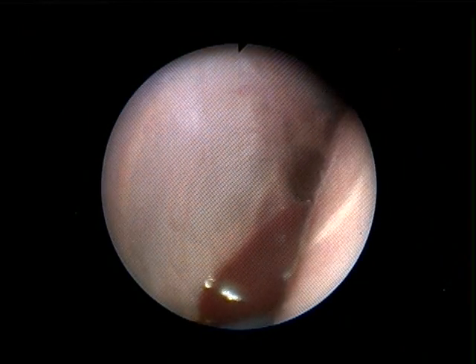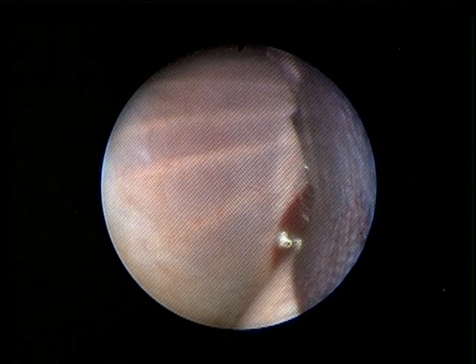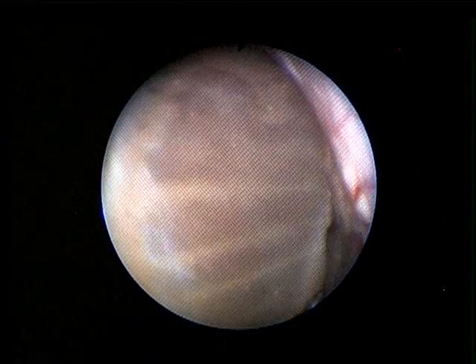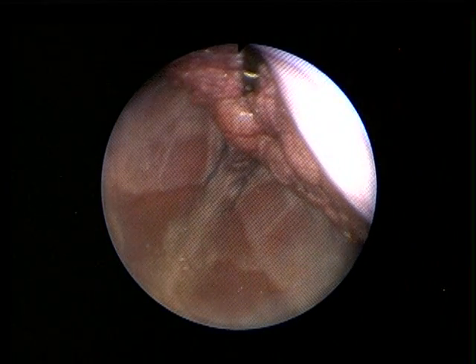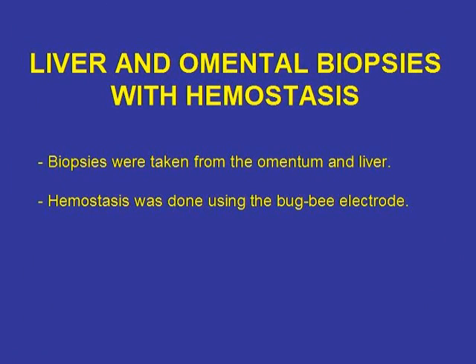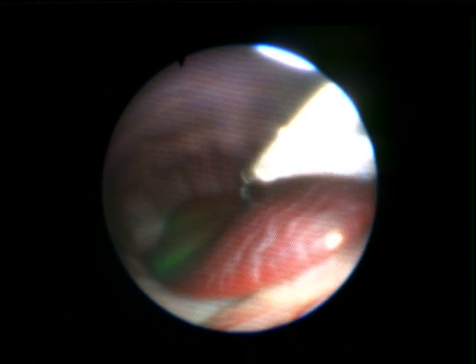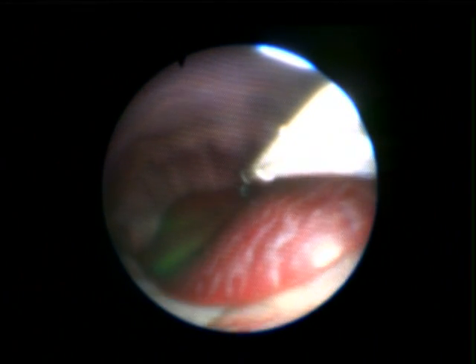All the quadrants of the abdomen were accessed including the pelvis, which could be done by retroflexion of the scope. This shows the pelvis with the retroflex view. Biopsies were taken from the different lobes of the liver and omentum, and hemostasis was done using the Bugbee electrode.